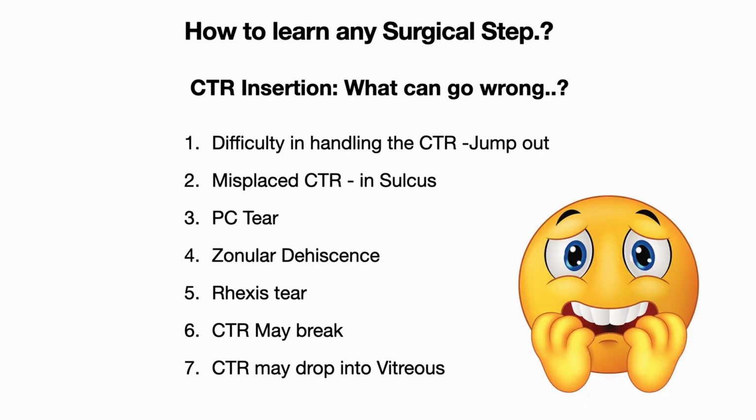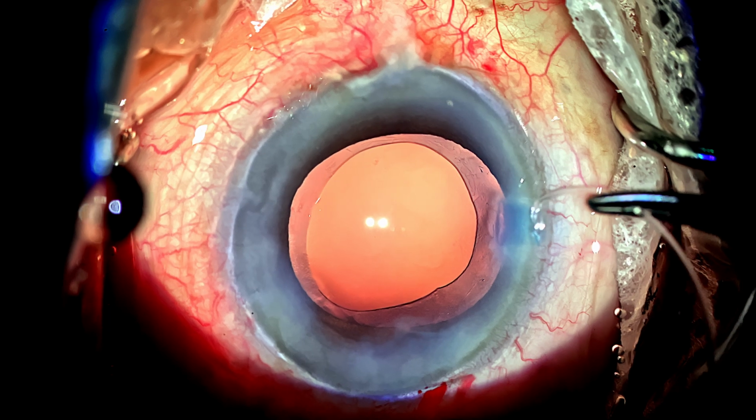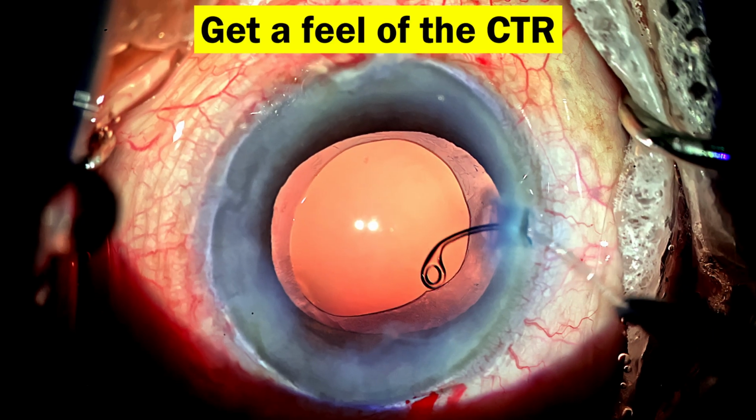Well, this list is not to scare you all, but it's important that we acknowledge the possibility of these side effects. So before we introduce the first CTR itself, we know what are the things which can go wrong, and we need to take adequate steps to ensure that the insertion is really smooth and safe. So the first thing obviously is to get a feel of the CTR itself.